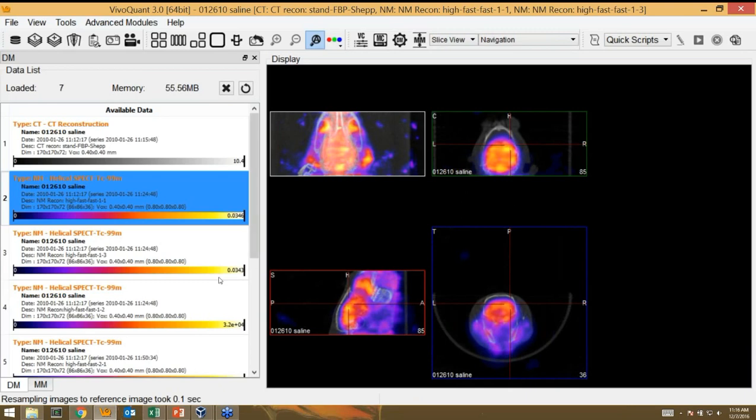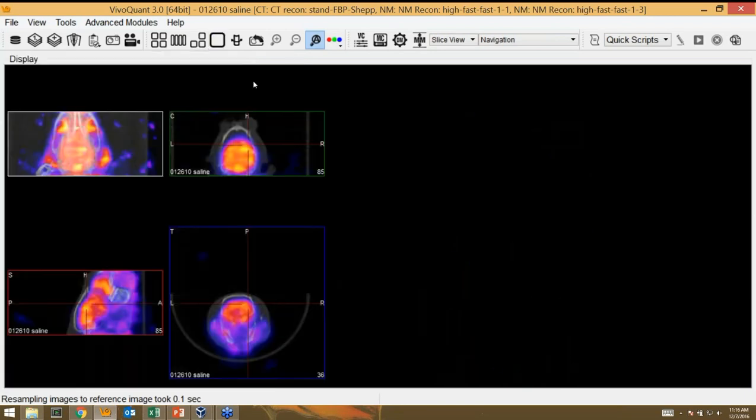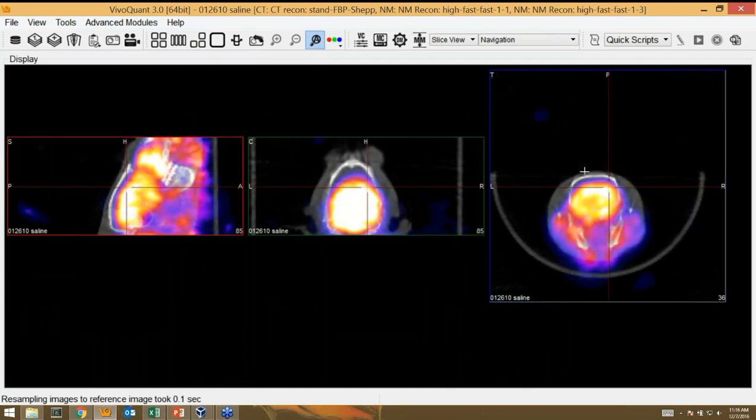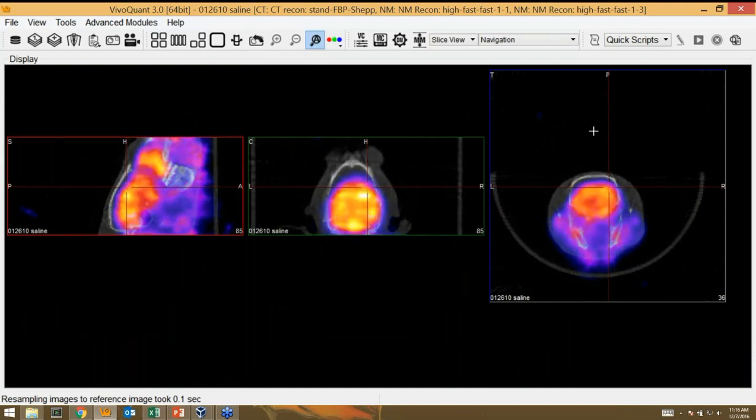However, one thing that we've now added is additional controls to that. So sometimes maybe you don't want to be looking at the data list, but still want to adjust how that data look and feel on the screen. So what we've added now are essentially right-click controls. If we right-click in the image and drag down, the image, as you see, will become brighter. We're essentially pulling the color palette down. Or the opposite, we can go up from the bottom to make it dimmer.